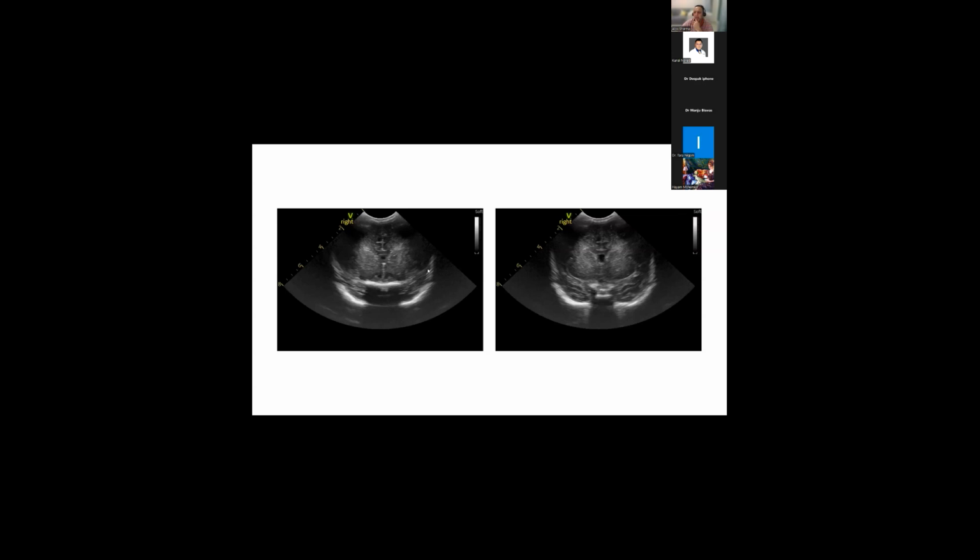And I've always said that your image should fill about 3/4 of the screen. So we can increase the depth to about 6. And in order to get more lateral gain, in the upper part of the image I can change my time gain compensation to make it a little bit brighter, increasing the return of signal from these areas, which will give me a more uniform appearance.